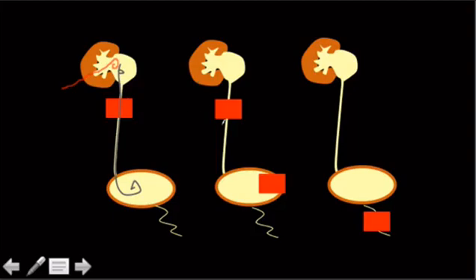All right, next situation is you've got a problem in the ureter, but also the bladder doesn't empty correctly for whatever reason. There's something wrong with the bladder. So if you were to give him a double J stent, you would just be draining into a bladder that doesn't work. And then you would have urinary retention issues, and you'd end up getting all kinds of problems there too. So it doesn't make sense to drain urine into a bladder that doesn't function.